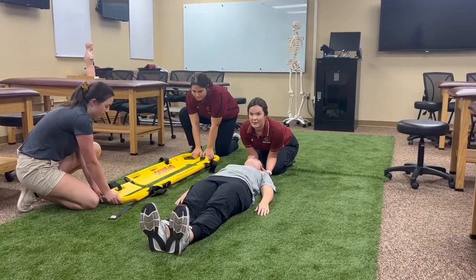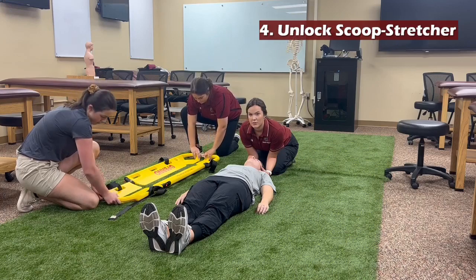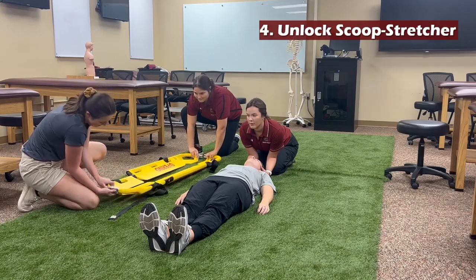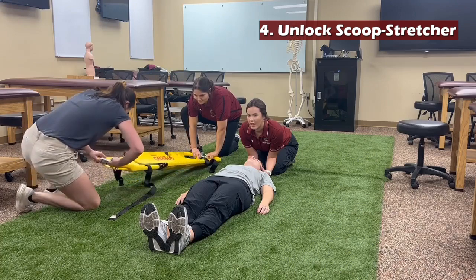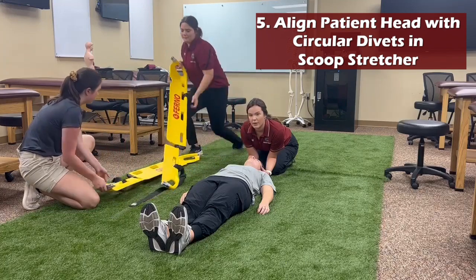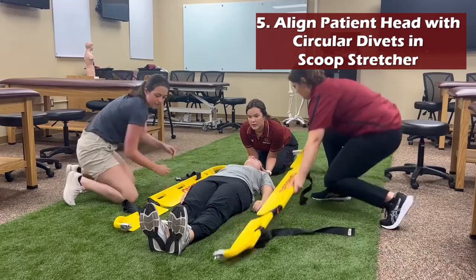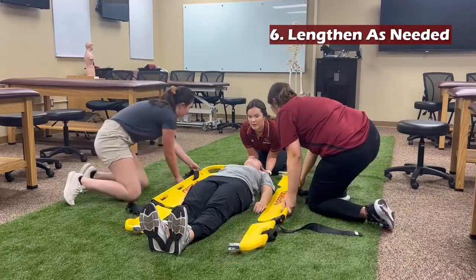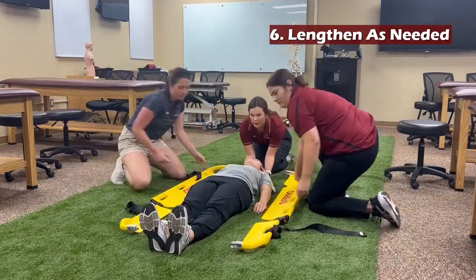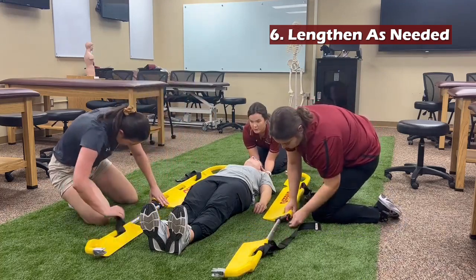Okay, so by this time the scoop stretcher would have made it to you. So what you'll do is you'll unclip the scoop stretcher at the top and the bottom. And you'll line the divots in the board up with the patient's head. If the patient's taller, you may have to lengthen the bottom to make sure that their feet stay on the board.